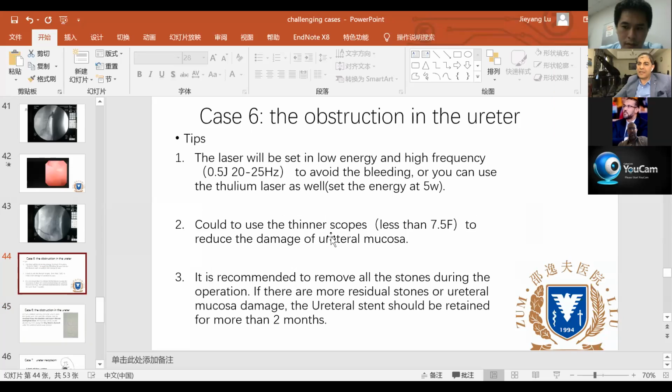No, I will let Dr. Lu answer, but I think it was very clear in the video that it is not just mucosal edema or granuloma. It's clear that it is a lesion, a mass, with a high possibility of urothelial tumor. It's totally different than when we're facing an impacted stone with mucosal edema or granulation tissue around. You can recognize the difference easily between both of them. And what he did, he just took it as an excision biopsy, and it's done very nicely. I believe it has been resected very well, especially the first one with the pedicle. And the second one also has been removed nicely.